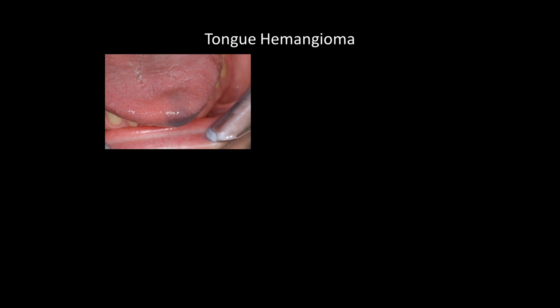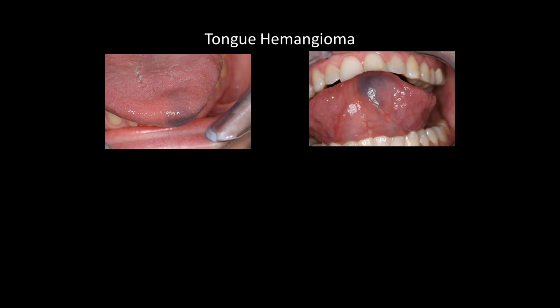Who would do that? So this very large lesion on the underside of it, you can see how big a varix or hemangioma this is. The way I approach this, I told the patient right away that there's no way I'm going to get rid of this in one session. My goal would be to shrink it down by at least 50% with the first session, and then go back in a second phase, treat it again, and maybe even a third phase, until we've eliminated this.